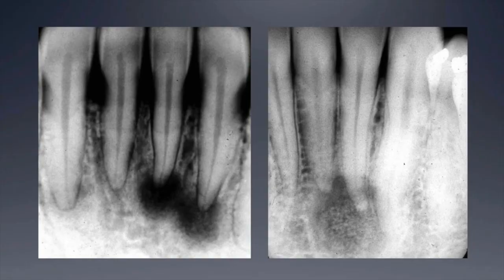All right, here you have some periapical lucencies, as you can see. They look pretty standard, and they should really be evaluated by an endodontist. The key here is that the teeth are vital. So you have periapical lucencies and tooth vitality.